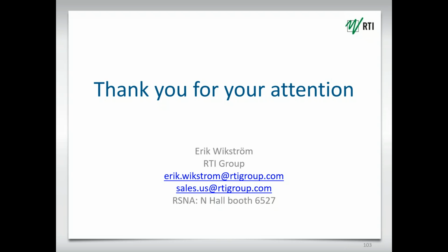And you can do that with any instrument data, of course. So in that case, it works the same way as Excel would work. The difference there being that with Ocean, you could build a database in the same way that you're doing with an RTI instrument. So yes, you can have a pool of both RTI instruments and other manufacturers and still use the Ocean software and share the database.